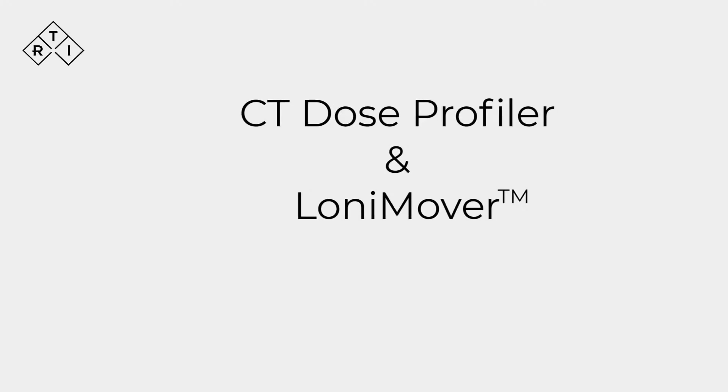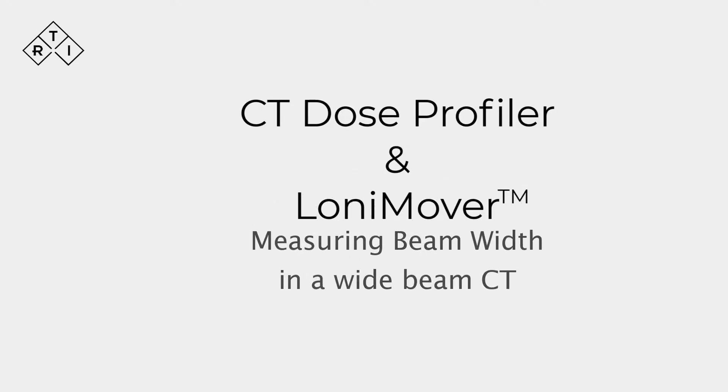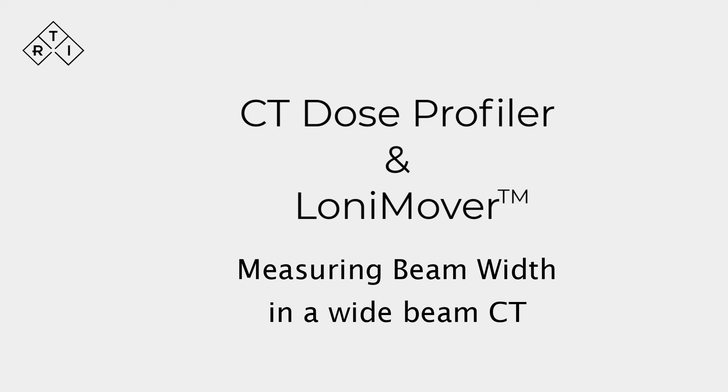Welcome to this demonstration of how CT beam width is measured using an RTI CT dose profiler and a LONI mover.